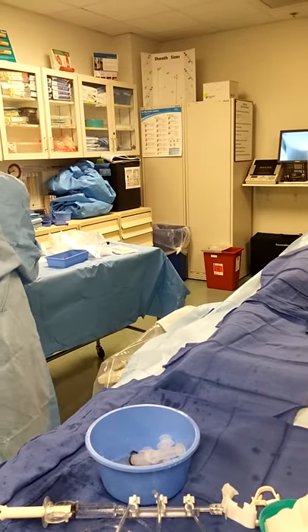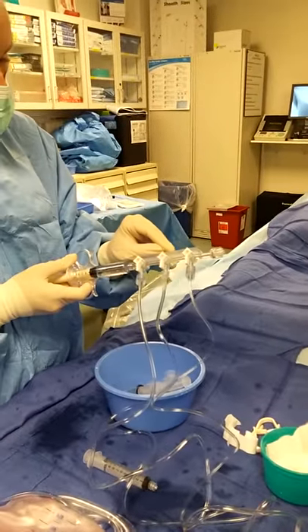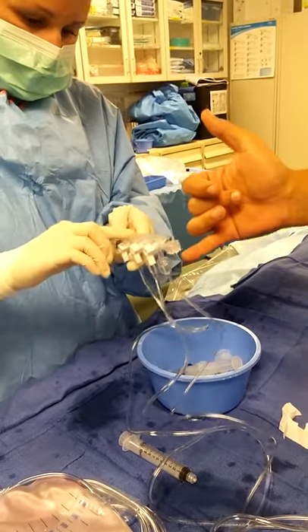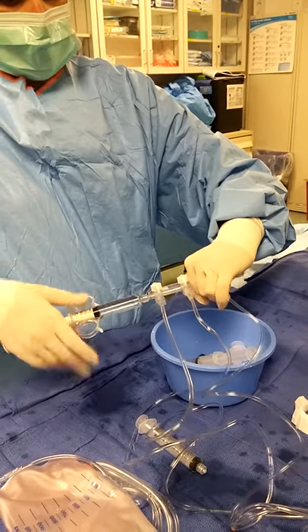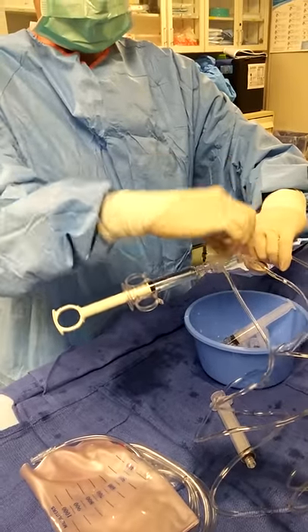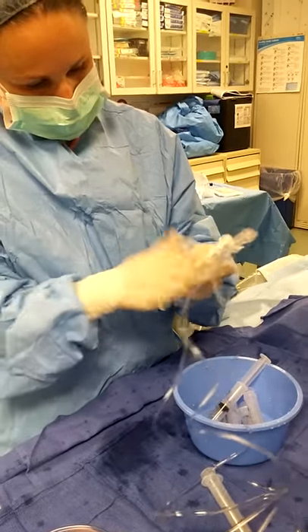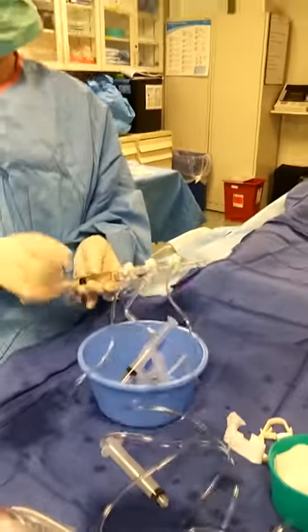I know the fat, short, chubby one is the contrast. Maybe yellow is contrast — we'll read the package and see. The most distal here is always your pressure — that is correct, that's always pressure. So don't even look at that value. It's really a battle between two places: the short, fat one is your contrast and the skinny one is your flush. Make sure these little wet spots aren't bubbles — you might have to wipe and hit and draw back. Remember, bubbles like to live in luer locks, especially if they're not tightened all the way, which is why that should be the first thing you do before you start setting it up.